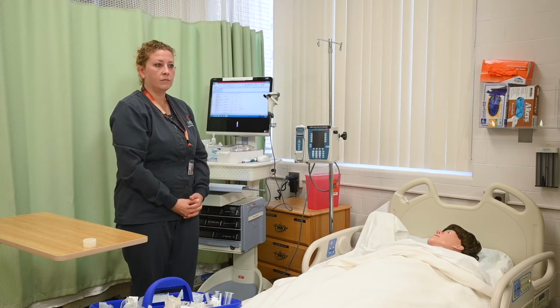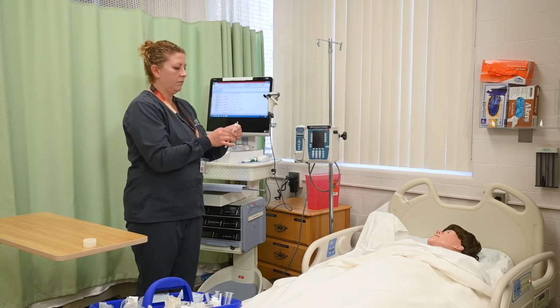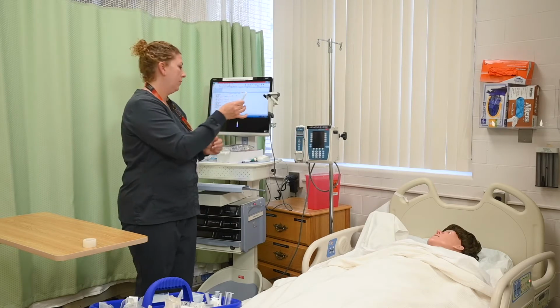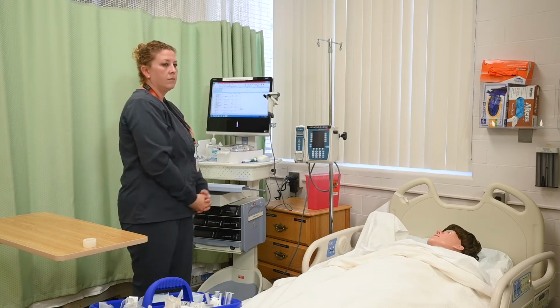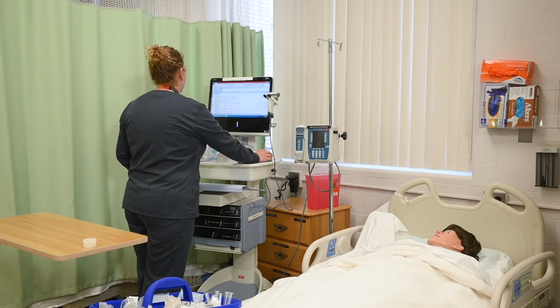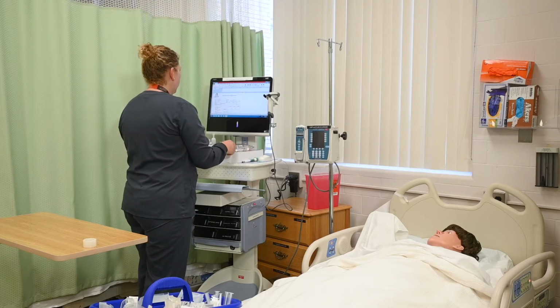Now open the flush and purge the air from the syringe. Adjust to the 2.5 ml dose. She will now perform the second check of the 5 rights of medication administration of both the IV solution and the normal saline flush, comparing to the MAR.